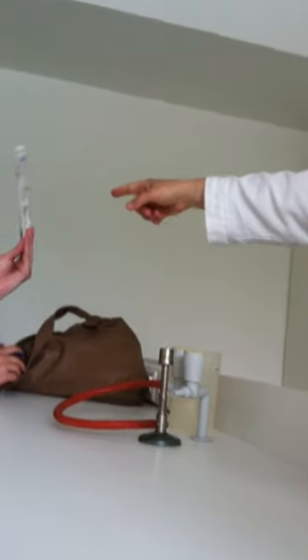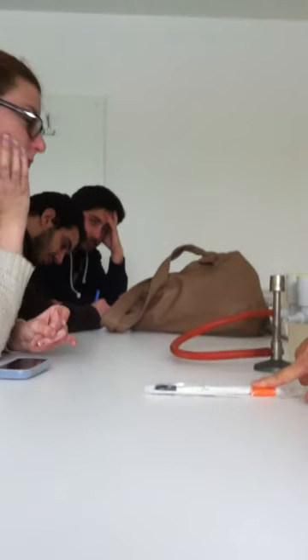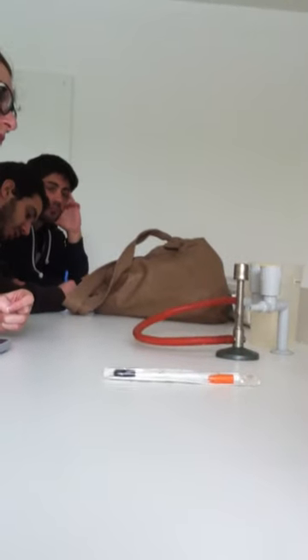So this is smaller and for fastidious bacteria. The transport medium is very good for surviving. So bacteria will survive but not replicate, but it's okay. Keep it at room temperature, never at the refrigerator. And I forgot to mention that the chlamydia or papilloma you can keep.